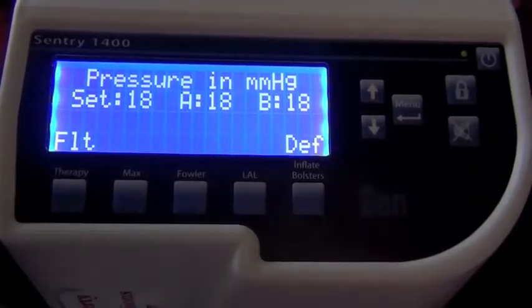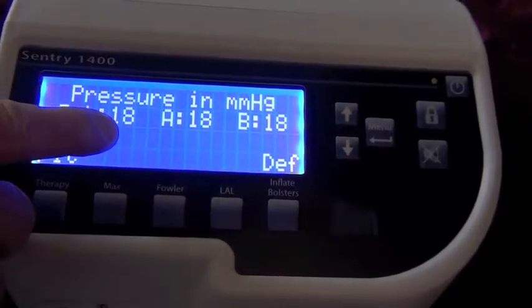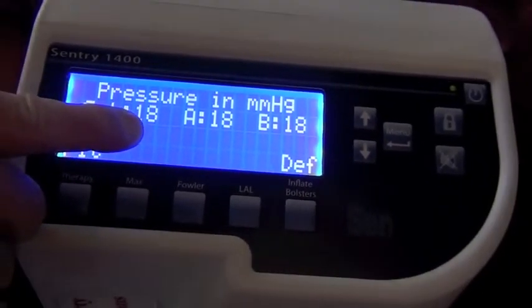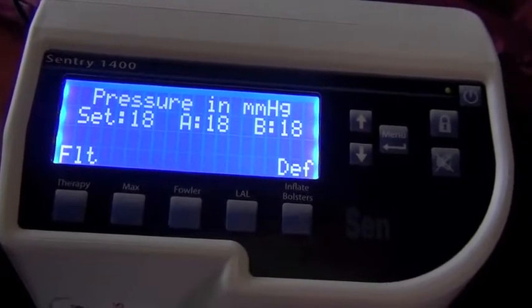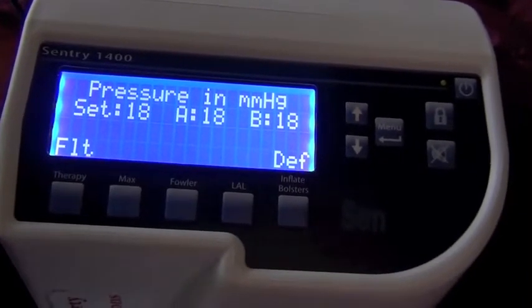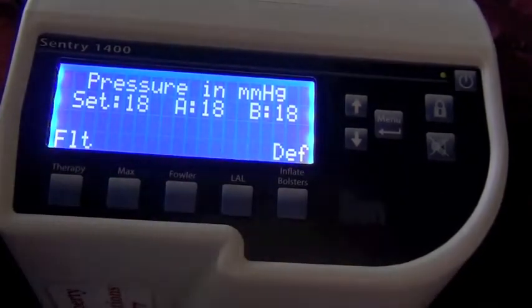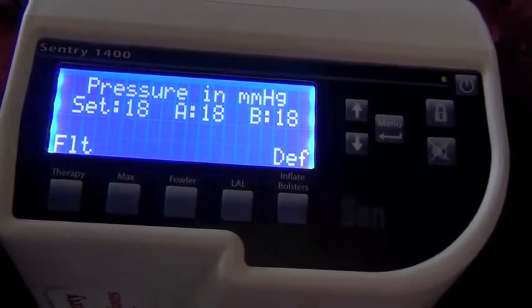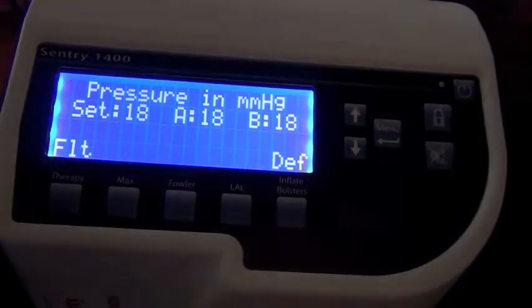Now that weight we put in kilograms initially has a reference set pressure for the system. That is what you see here. That's what that number means. The number 18 really has no value other than a reference for you to know that that is the set pressure for the system and that we need to be achieving that pressure in order for the system to be operating properly. In the float mode, we're using all 20 air pillows.